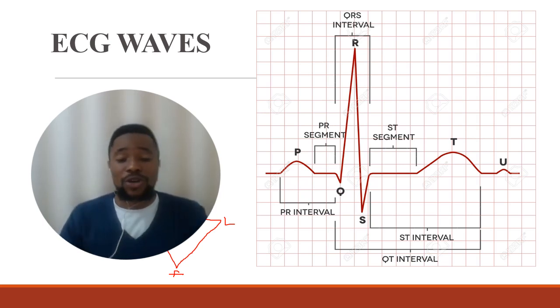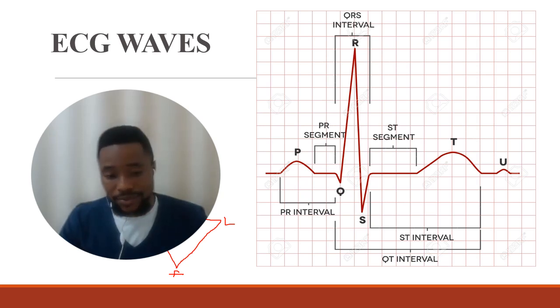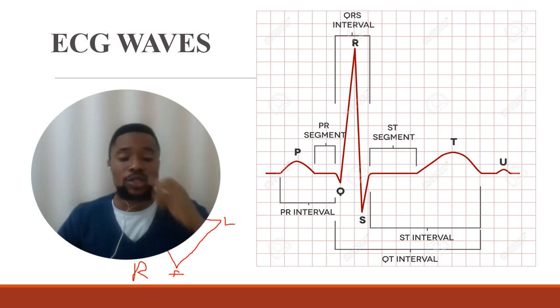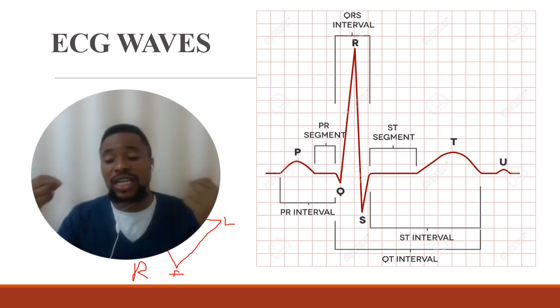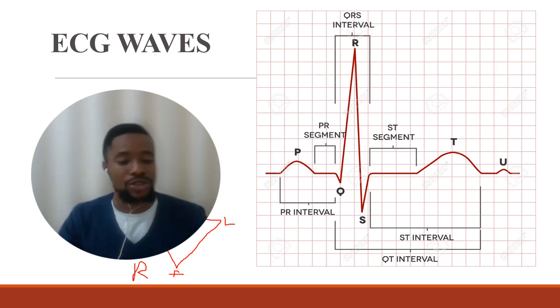So now, this is your right hand here. The right leg here is used for earthing on the ECG. In some other class we'll teach you better how to place electrodes. The right leg is earthing. It does not contribute to the formation of the 6 leads. So now, this is your right hand, your left leg, which is a foot, and your left hand. A negative charge from the right hand reacting with a positive charge from your left hand forms what we call lead 1.